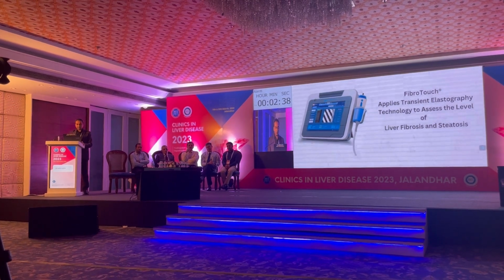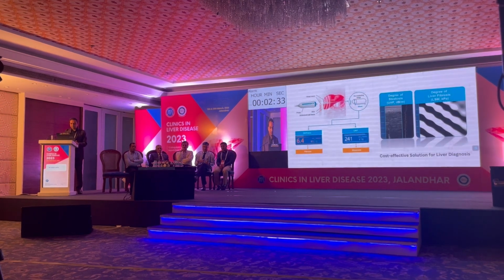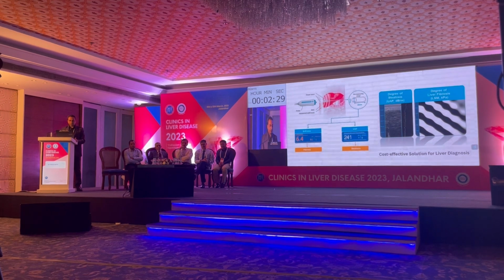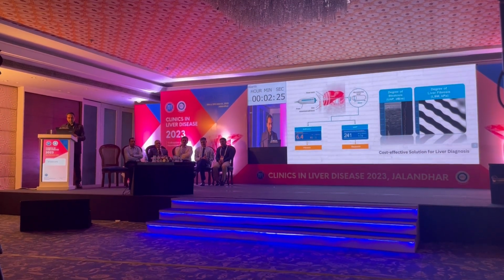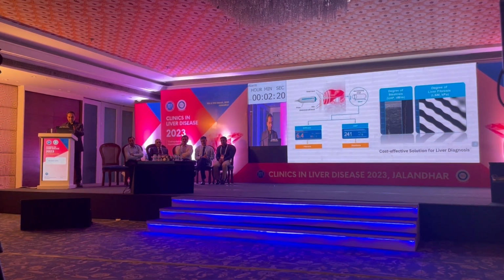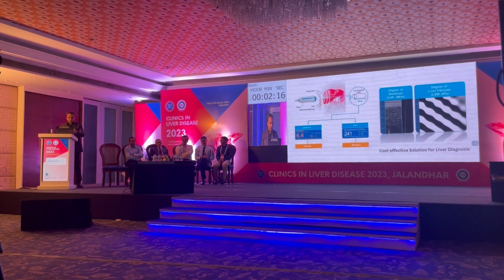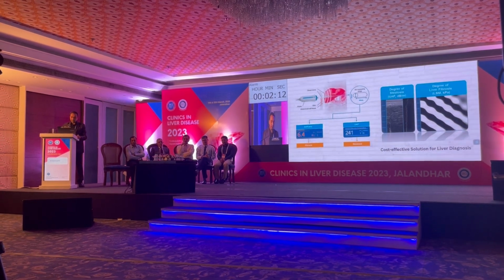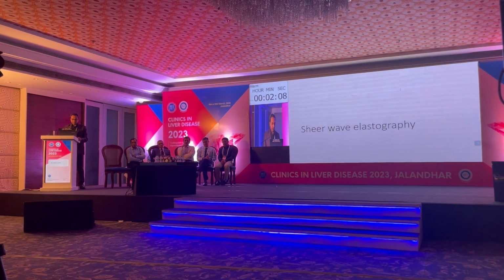Technology is now FDA approved. What about it? It's FibroTouch technology, and its usage keeps increasing, and we will keep seeing these technology reports, and we need to be equally aware of these technologies, and the reports can keep coming to your chambers. The modality is similar to FibroScan and EchoSense with stiffness, but they call it UAP instead of CAP, and otherwise there is not much difference in both the modalities.